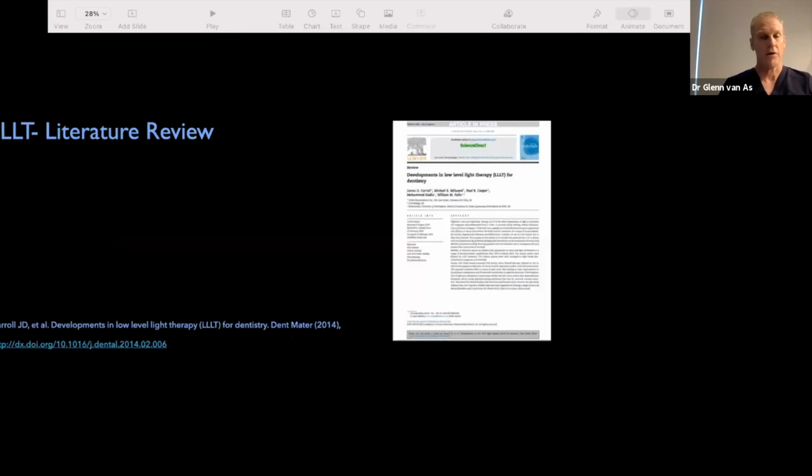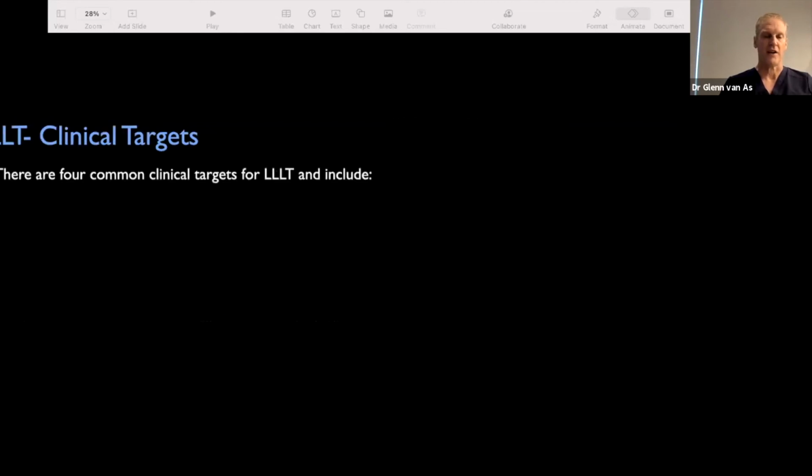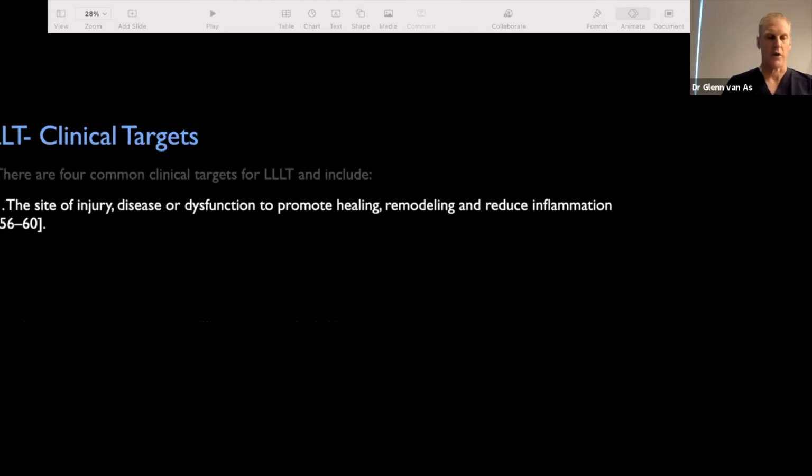James Carroll is an awesome guy, done a lot of research on this, written an 83-page review in 2014. It said the benefits of low-level laser therapy include improved healing, decreased inflammation, and decreased pain. Thus, it could have considerable potential for use in oral tissues. And since that time, many, many well-designed studies are showing that lasers can be used to help you with your surgical cases. There's 4 common clinical targets, and a lot of these slides are from Jerry Ross, who's an expert in Canada on low-level laser therapy.